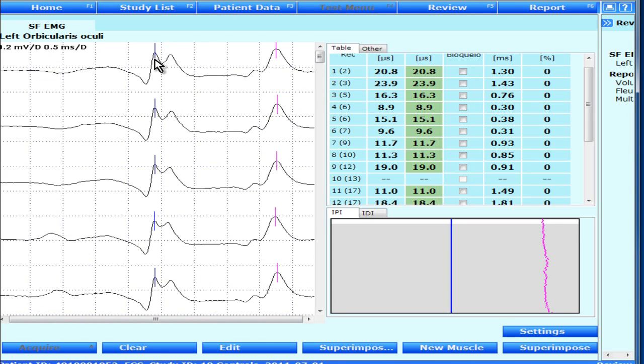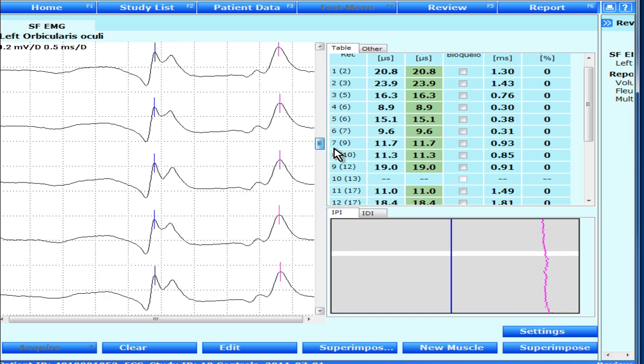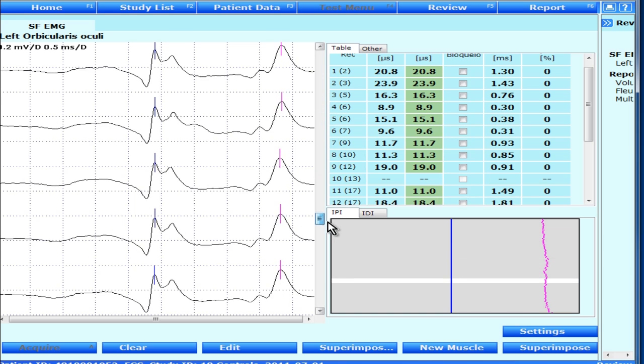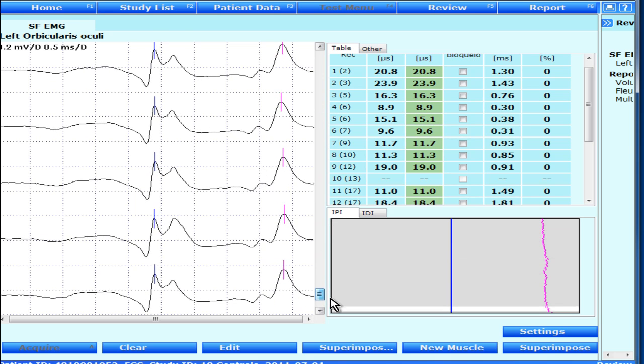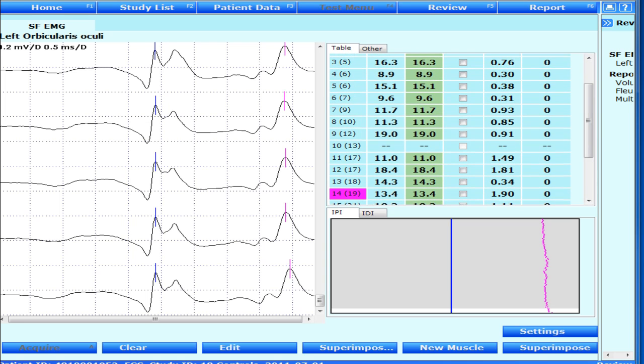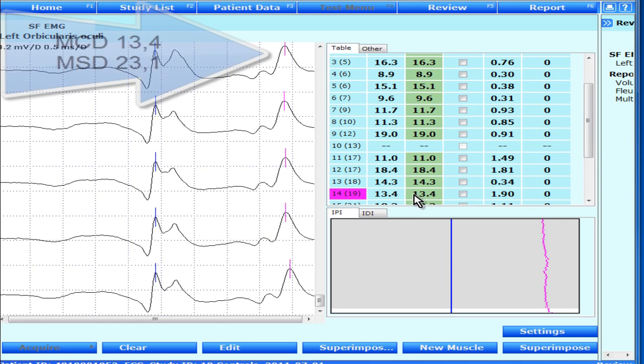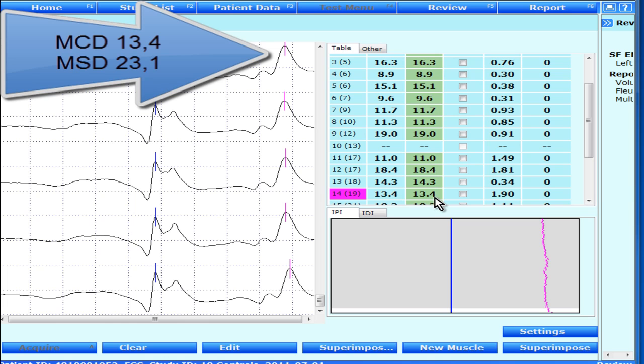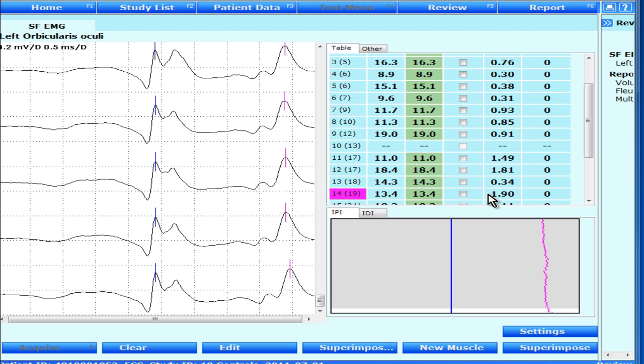Here is a recording where two spikes have been accepted and it looks pretty nice and straightforward. In this case, the MCD is 13.4 and the MSD is 23.1, not shown here, and that is due to the trend in the material.